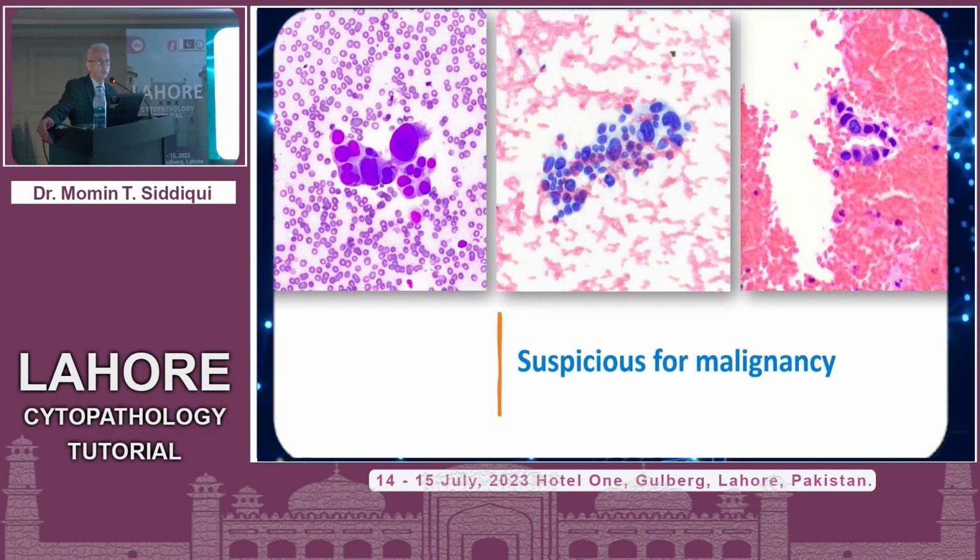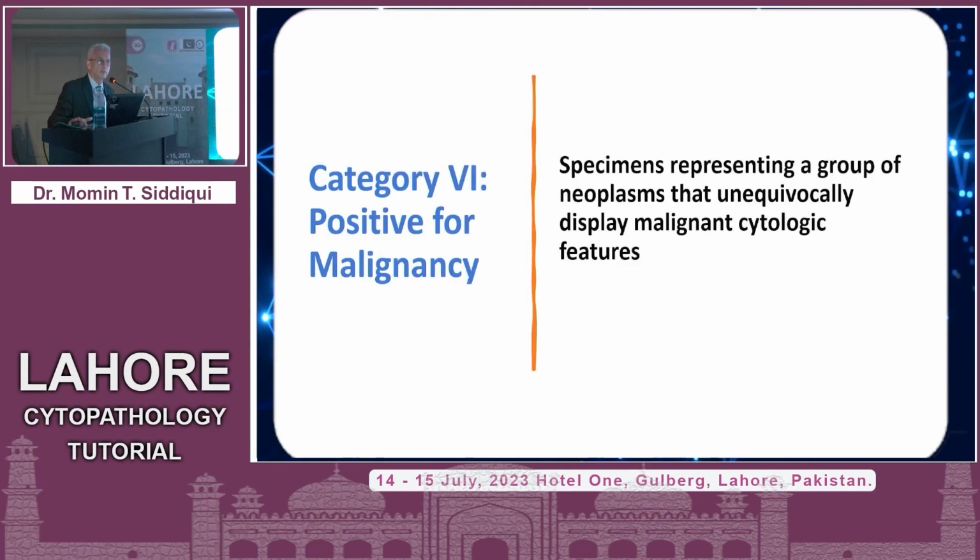For making an outright call, the PAP Society doesn't give you a cellular count or numbers, but certainly it's up to you and your comfort level as to how you want to address it. So again, once a call is rendered of an outright malignancy on a limited sample, then you are basically responsible for it, and be aware of pitfalls if they are in play. So again, I would not recommend making outright calls on cases as limited as these 3 cases.